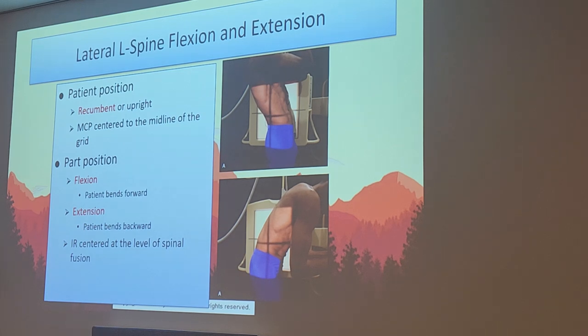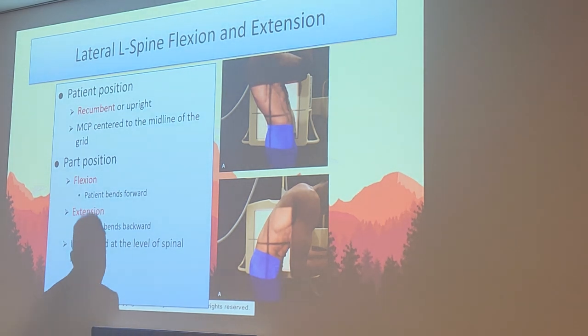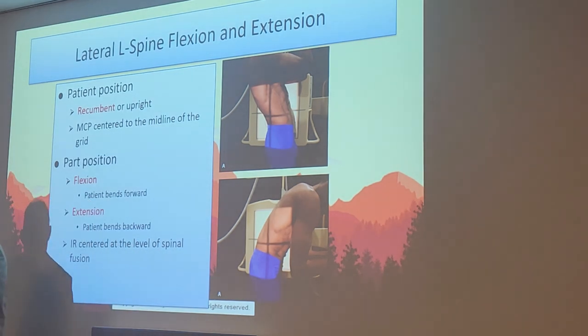Typically, if you're going to do this standing, you want to have someone standing out there with them, holding their arms. Because as soon as they start bending, they're going to keep going back. They're not going to stop. Or even when they're going forward, they're going to keep going forward. You ever watch a toddler walking around, when they put their head forward, their whole body goes like this? That's what's going to happen. Toddlers run with their head.